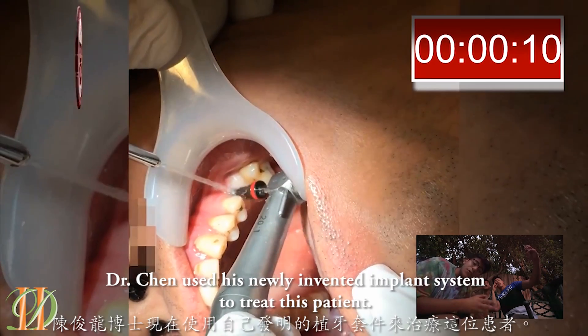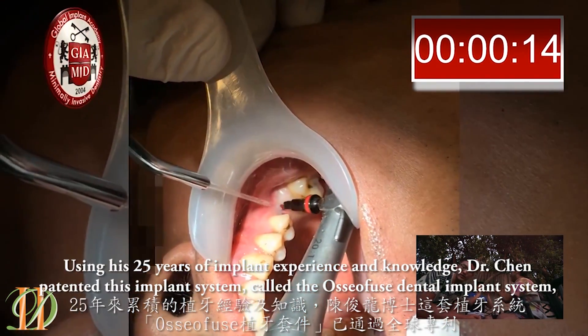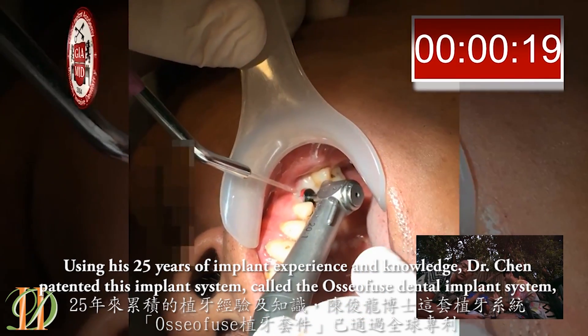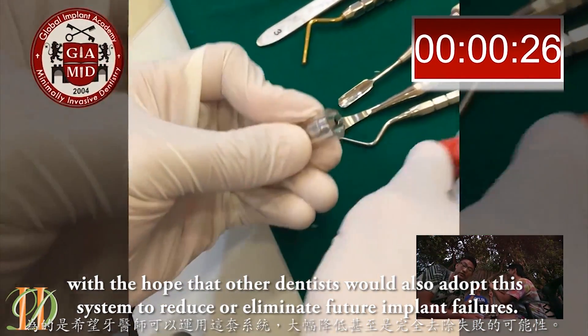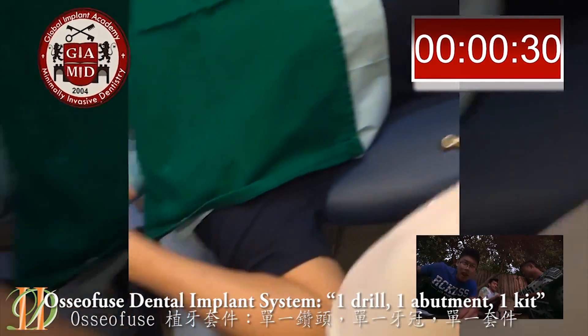Dr. Chen used his newly invented implant system to treat this patient, drawing on his 25 years of implant experience and knowledge. Dr. Chen patented this implant system called the AlsoFuse Dental Implant System, with the hope that other dentists would also adopt it to reduce or eliminate further implant failures. AlsoFuse Dental Implant System: one drill, one abutment, and one kit.